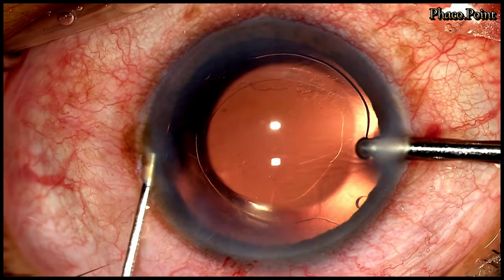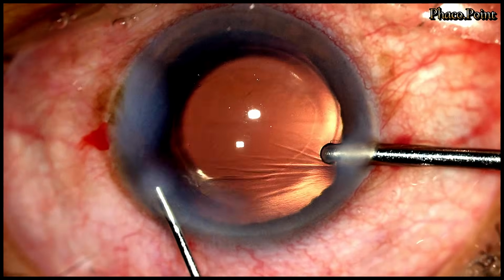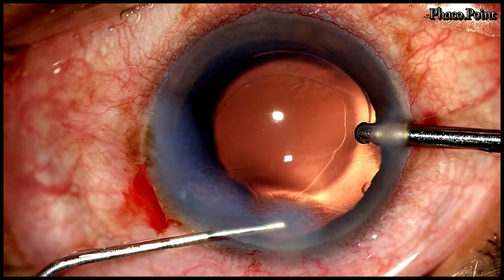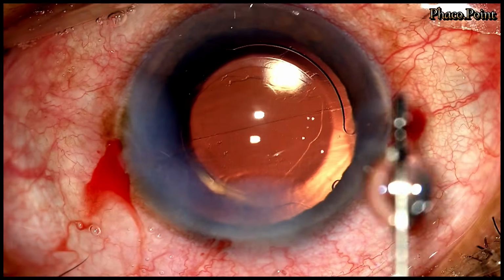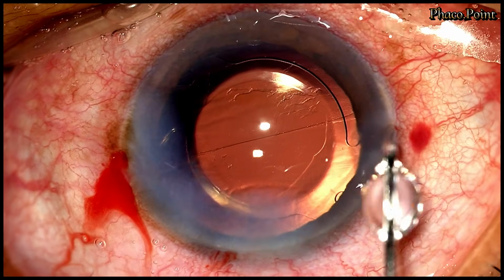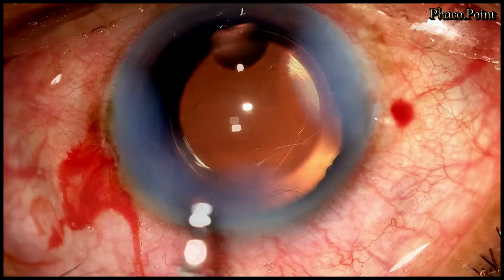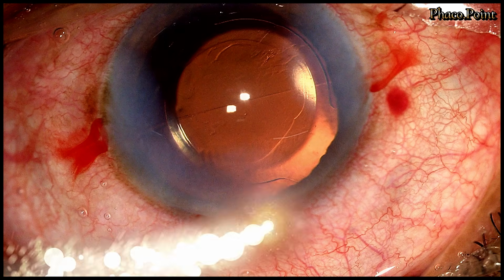Following the completion of the visco wash, I then proceed to hydrate first the left side port incision, my main incision, and whilst the globe seems pressurized, I don't see any folds. Upon removal of the irrigation, once more the folds occur once the eye becomes hypotonous. I end with hydrating the right side port incision, and that then brings us to the end of the surgery. Even upon the completion of the surgery, you will notice the folds in the posterior capsule still remain.